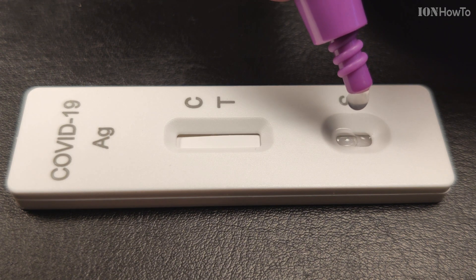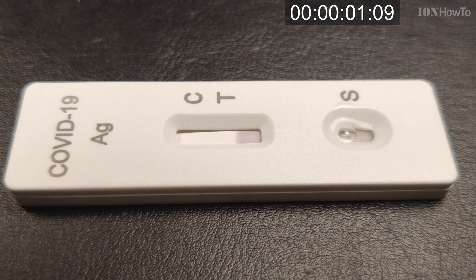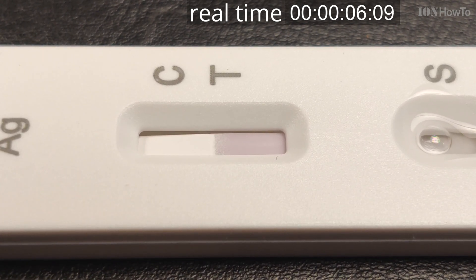I mixed it a lot more than shown in the instructions. Now the real-time clock starts after putting four drops of the sample solution onto the test.